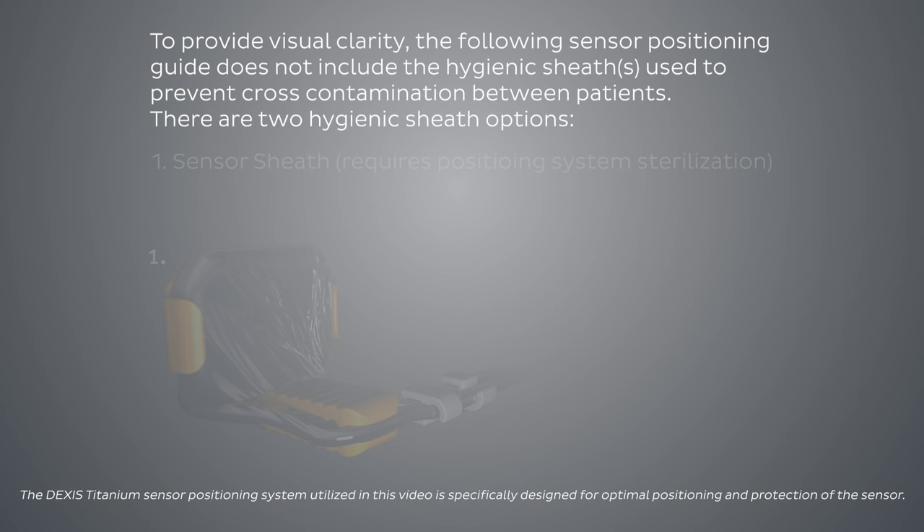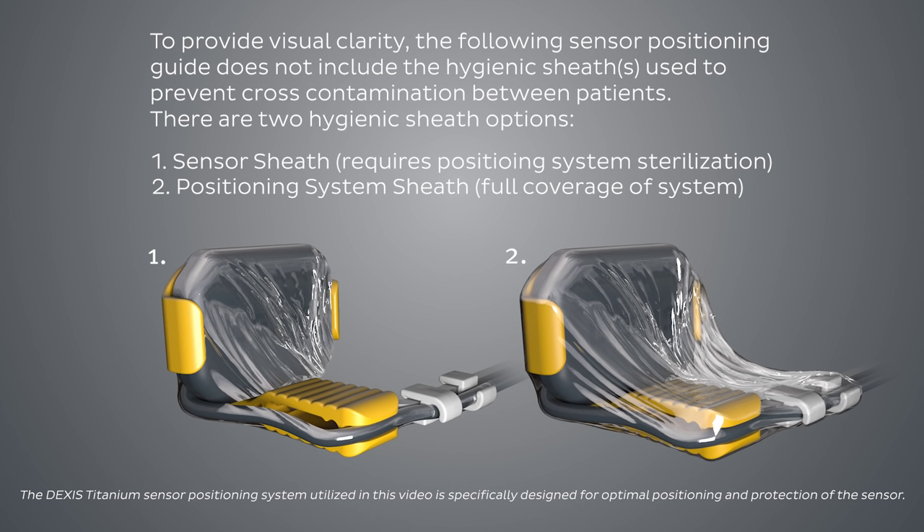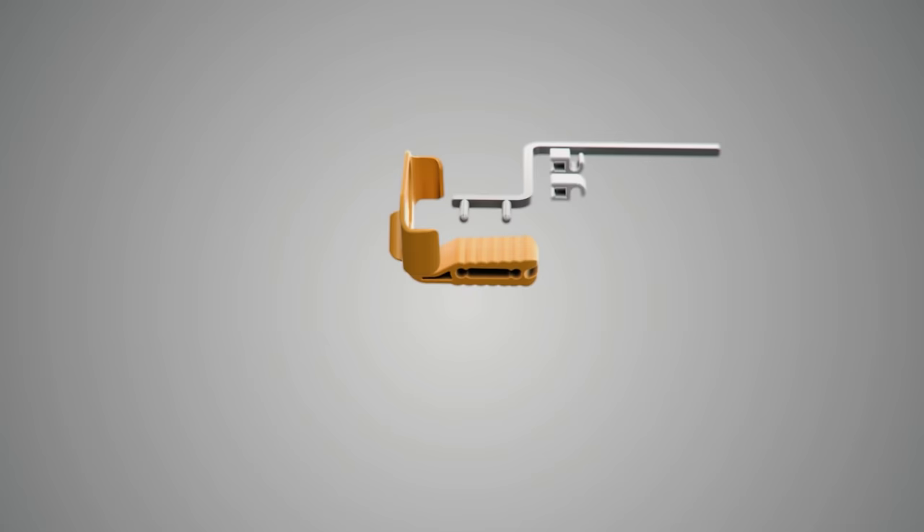Welcome to a guided tour of a full mouth series using the DEXAS Titanium Sensor by CAVO. For purposes of demonstration, the hygienic barrier has been omitted from this animated video. To help prevent cross-contamination between patients, place a new hygienic barrier on the sensor for each new patient.